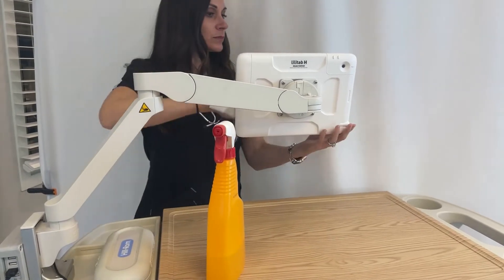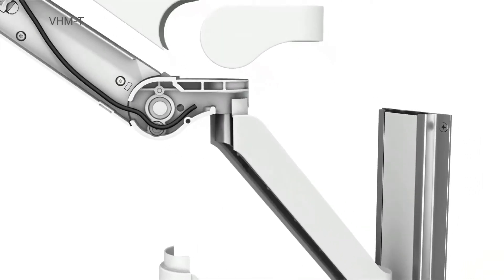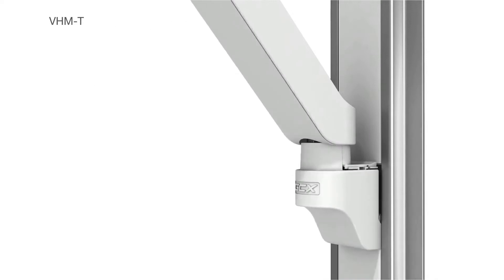This lightweight tablet arm also has integrated cable management to enclose the cords within the arm, enabling easier cleaning, simple access for service, and creates a professional-looking solution.